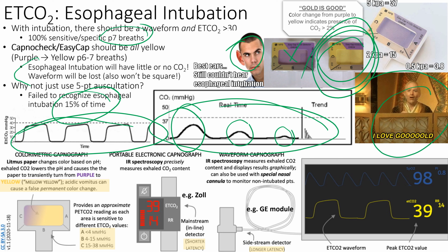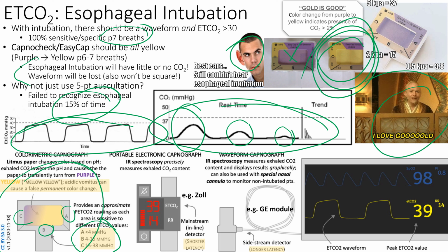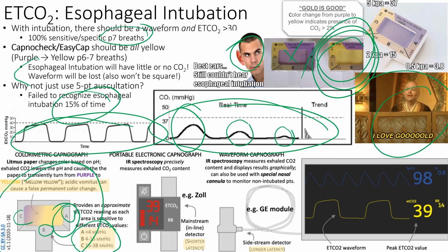But over here, listening to the stethoscope is not as good as hooking up to the capnography. Okay, so that's the idea, and this is a summary. Remember, this turns yellow, and there are different sections that can estimate what your CO2 is, right? If I'm barely getting the color change, say, yeah, it's because they're super hypotensive. I'm not expecting a really, really bright yellow.